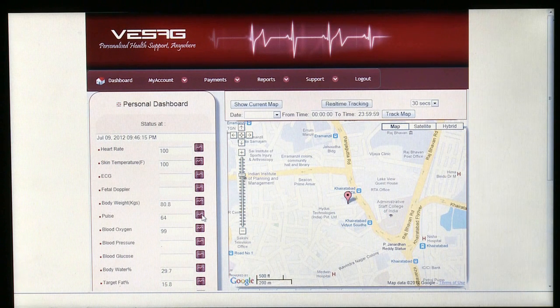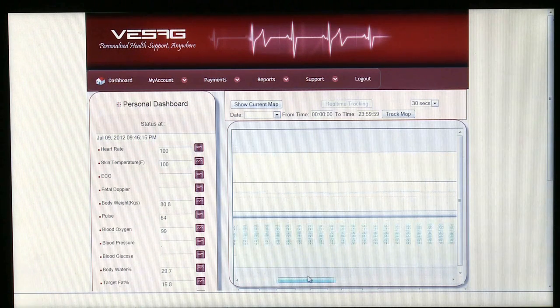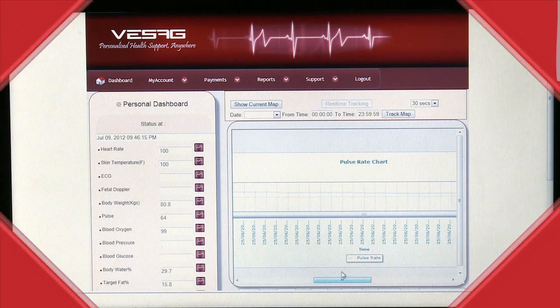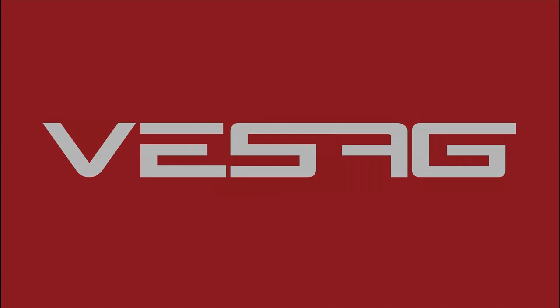By clicking on the Pulse graph, you'll be able to see Pulse information charted over time.